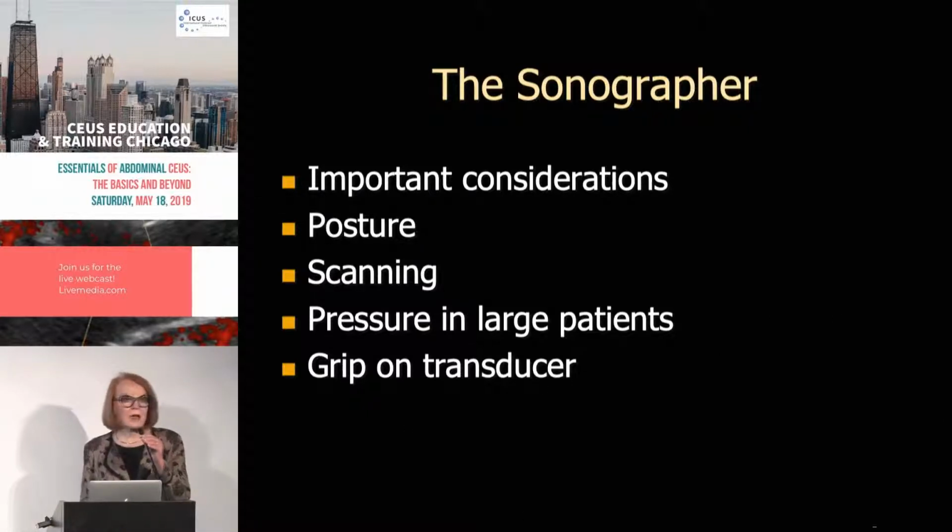So in a situation where we're looking at patients at risk for HCC and trying to follow the LI-RADS guidelines, which of course are based on the observation, including late and weak washout, that's a really terrific question.